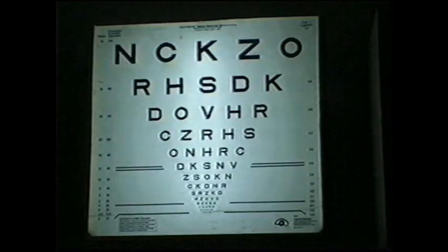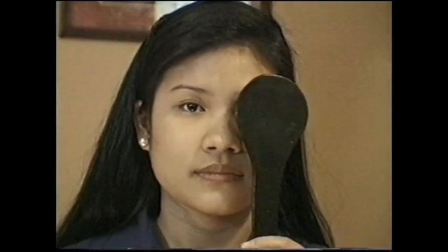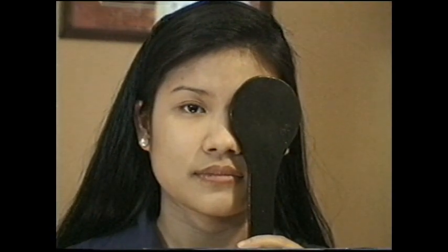Testing distance visual acuity. Number 1, ask the patient to stand up or sit at the designated testing distance, that is 20 feet from a well-illuminated wall chart. Number 2, occlude the eye that is not complained of. Ask the patient to make sure that the occluder is not touching or pressing against the eye. Observe the patient to make sure that there is no conscious or inadvertent peeking.